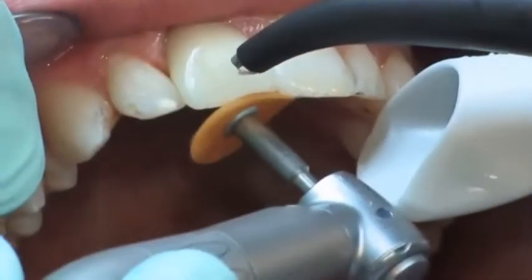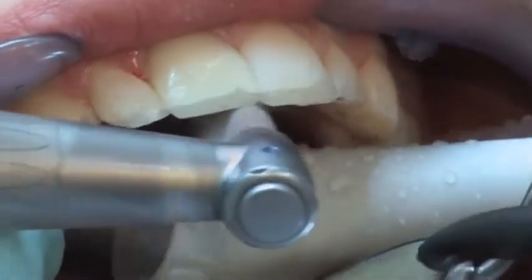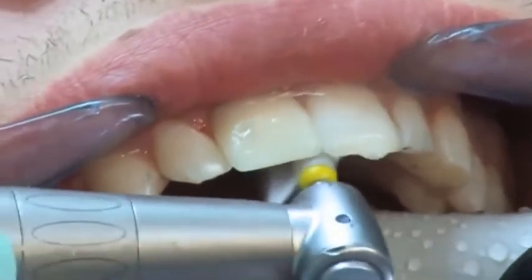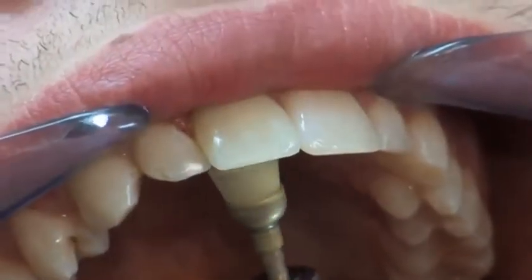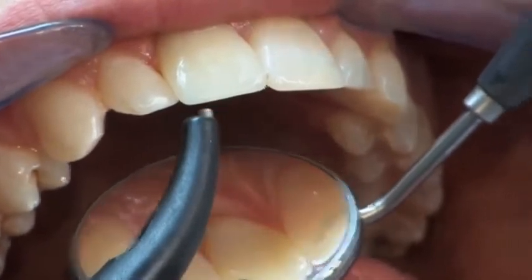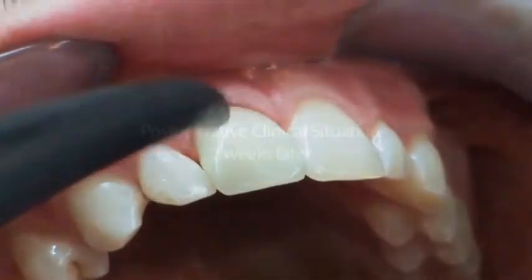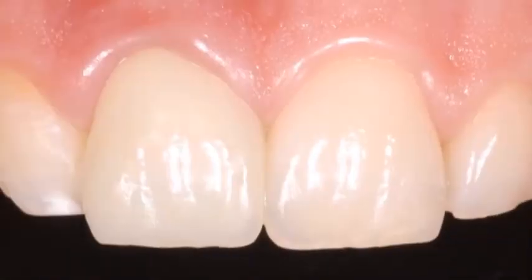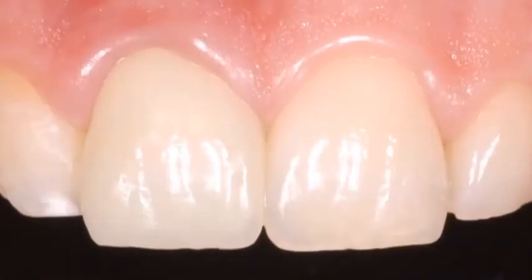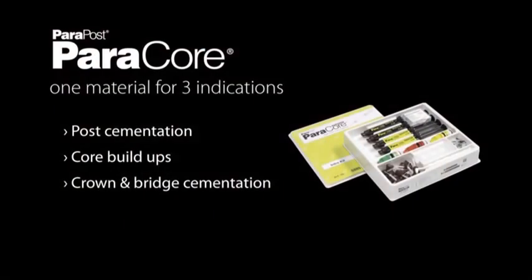The occlusion is checked and the surface is polished to a high glossy finish. Two weeks later, the post-operative clinical situation shows a successful clinical result after the application of Paracore, Parabond adhesive, and Paracore for cementation and the core build-up. This comprehensive aesthetic system is the perfect foundation for a successful and secure post and core restoration.